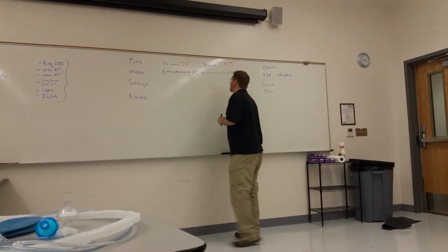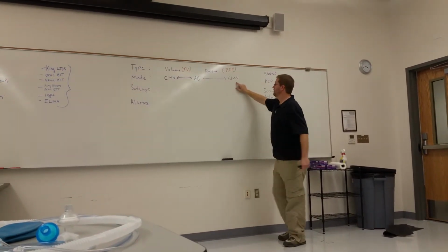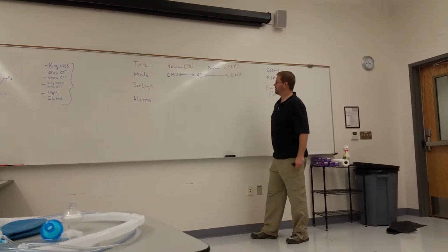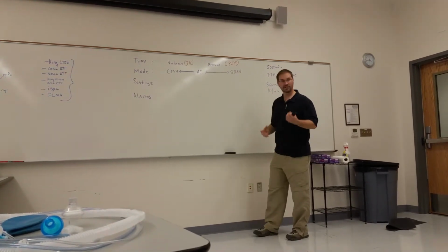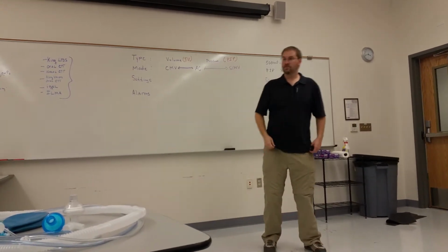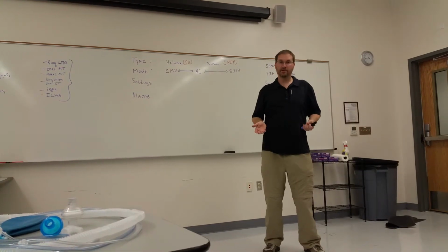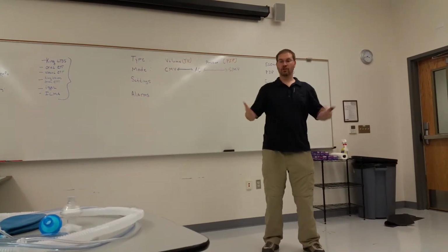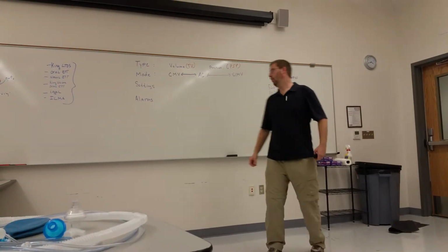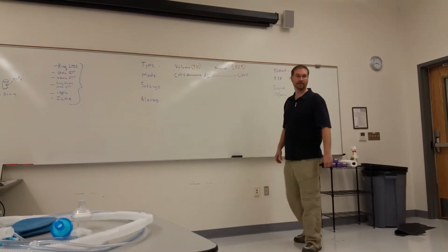And then finally, we move to the most interactive mode, SIMV, synchronized intermittent mandatory ventilation. In SIMV, the ventilator senses that the patient's trying to take a breath, and what does it do? Does it necessarily even help the patient? No, it just allows the patient to take a spontaneous breath. Does that kind of make sense?